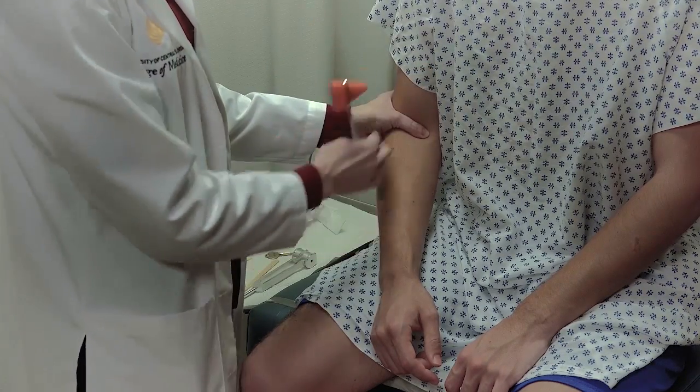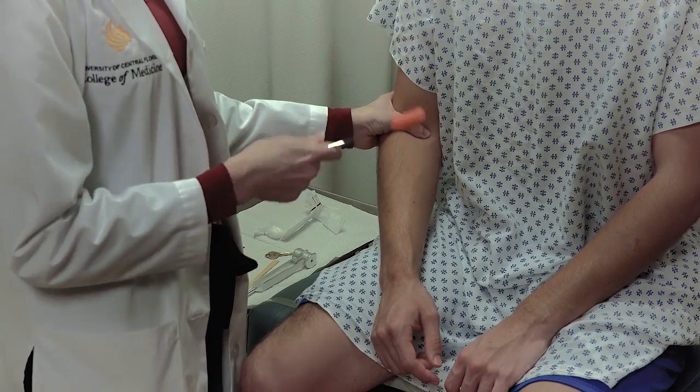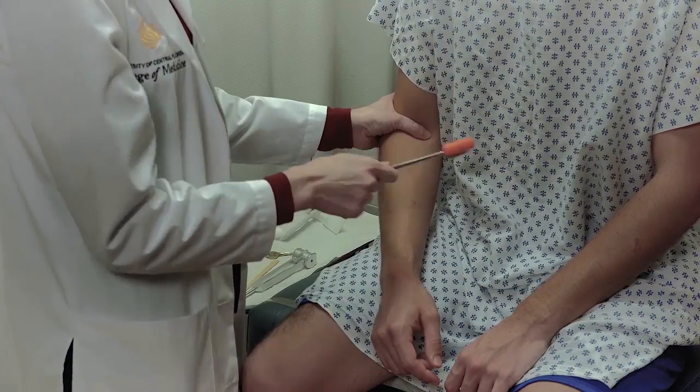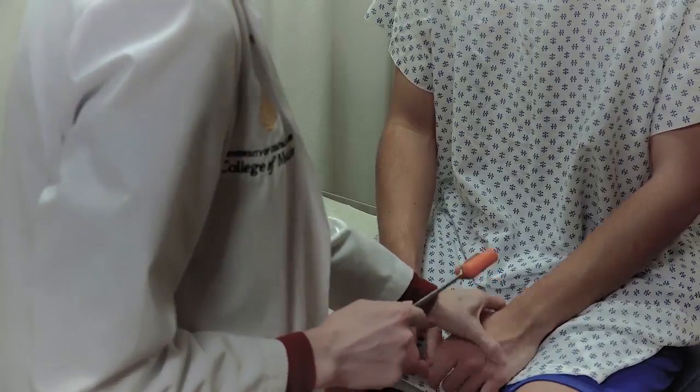You can see the arm jumping, and I can also feel the reflex myself. When you're doing the reflex, make sure it's a quick, rapid tap — not a plunk down and hold — just a quick, rapid tap. We want to make sure that we do that bilaterally.